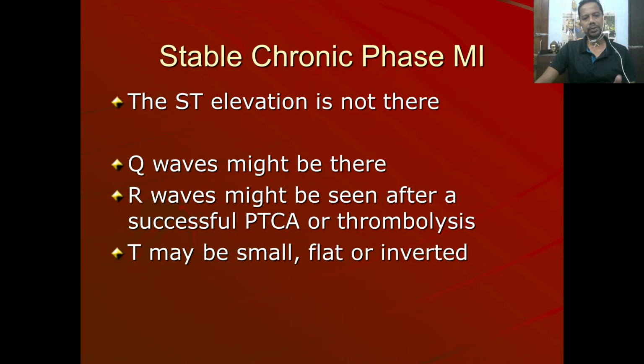thrombolysis-induced VPCs also. So you have to be careful of all these things, and you have to be observant, okay. And T may be flat or small or inverted in the chronic stable phase of MI.